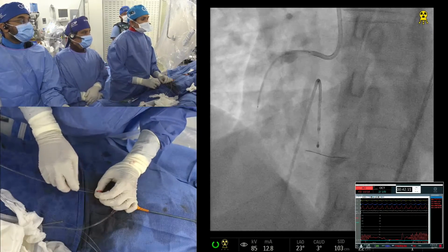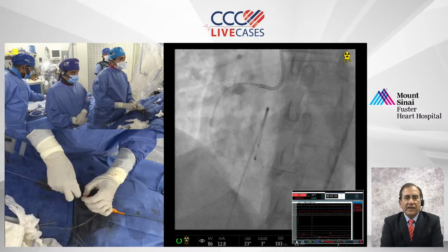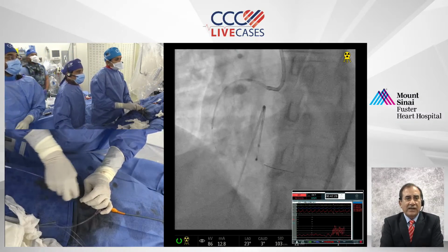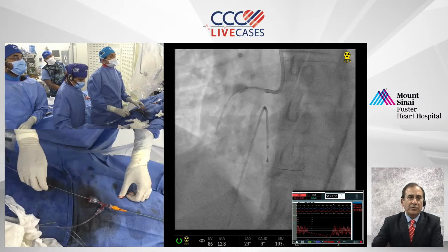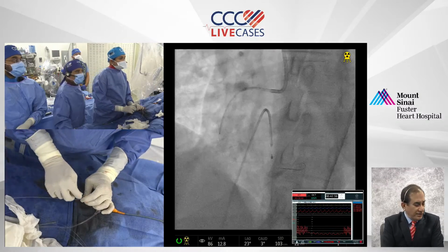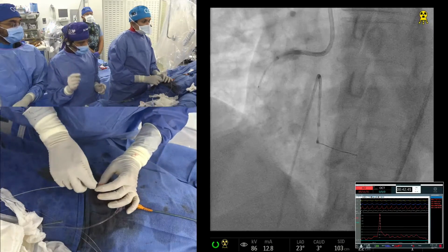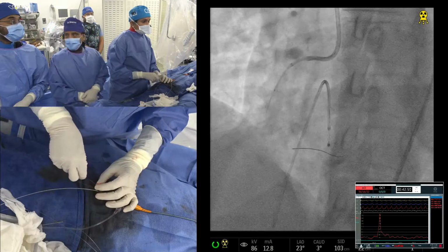So let me make a proposition here for you, and you tell me where exactly it is wrong. In a case with significant, fairly deep medial calcification, almost greater than a millimeter, does that make a difference in your approach, and would that make you consider IVL in addition to rotatripsy? Our own data have shown that IVL caused more plaque crack, more fracture of the calcium, compared to rota or orbital atherectomy.